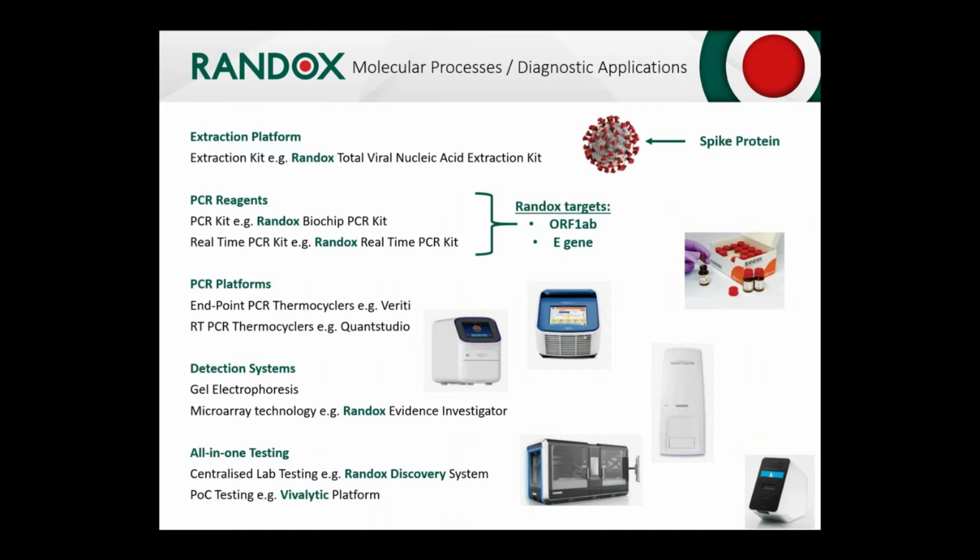No biological material should ever enter the master mix room, to ensure that the chemical reagents that comprise the PCR reagents are kept clean and in a sterile environment, to reduce any contamination that may be evident within the molecular lab. It's all about damage mitigation and ensuring that you've included quality management and quality processes in your lab to reduce contamination as much as possible. Once the RNA is added to your master mix PCR plate, a seal is added and it is put through for real-time PCR amplification or endpoint PCR, whichever technology you're using. The PCRs typically last for about 1 hour to 2 hours, depending on the assay or the targets that you're looking at.